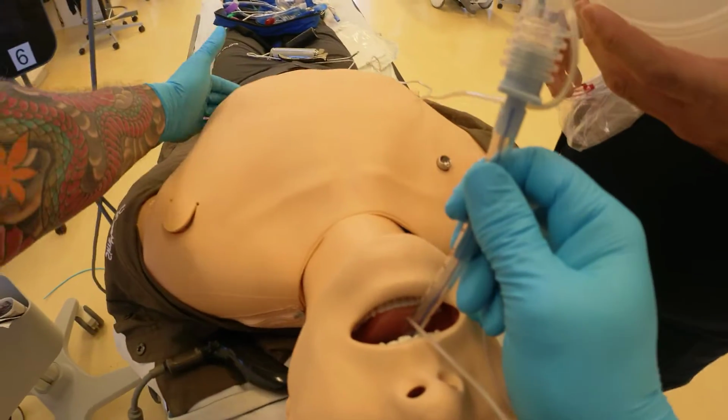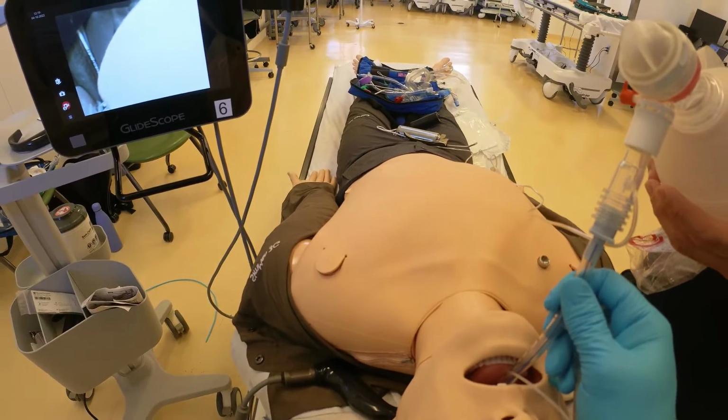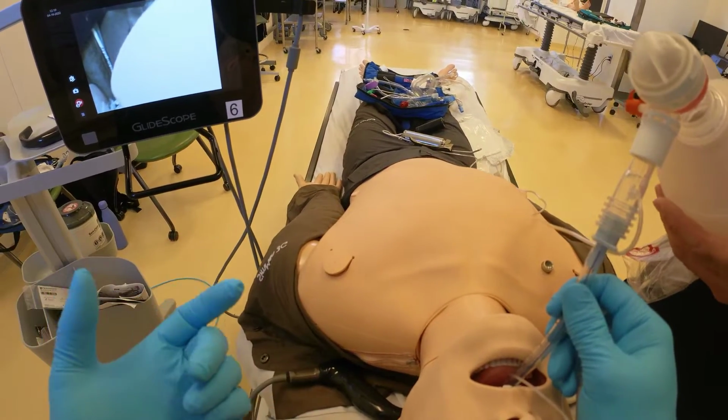I honestly don't even bother checking the epigastric sounds because I know it went through the vocal cords and we saw it on the screen. So this is how I would confirm. This is how I would write it up on my ACR.